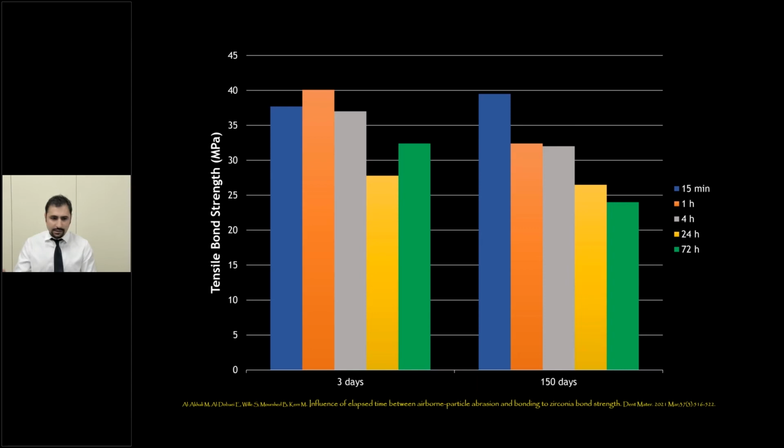So I highly recommend that when you have a zirconia crown, I understand that it's possibly sandblasted before, but always the lab techs recommend to dentists, hey, if you have a micro etcher by your side, after you tried it and checked everything, just briefly sandblast it very quickly. It's going to take 10 seconds of sandblasting, 20 seconds of rinsing it with water and pressure. Not a big deal. Then we're going to jump to a very fresh surface. We're going to have way better bondability, and the bond is going to remain high for a longer period of time. So that's going to be a huge change.